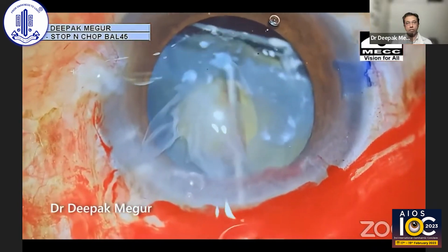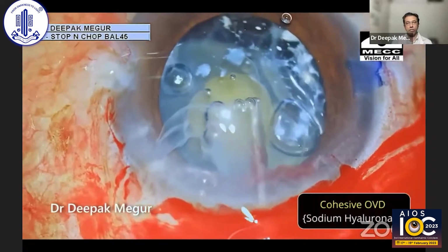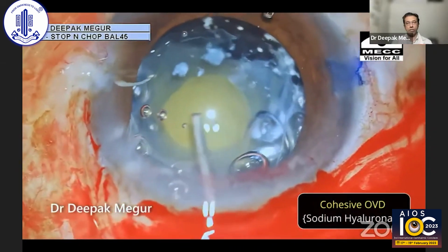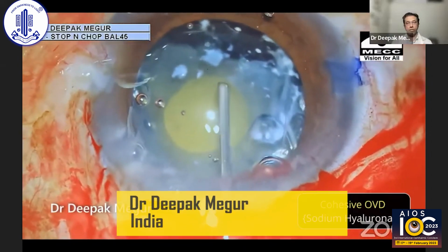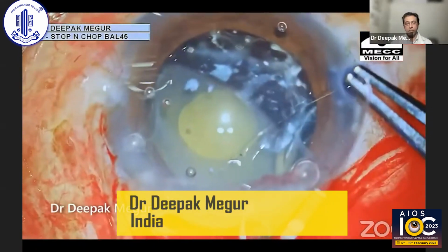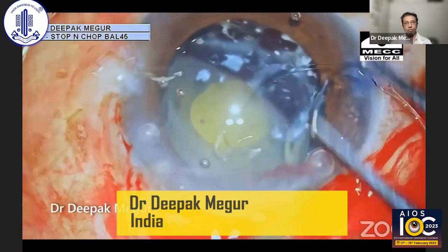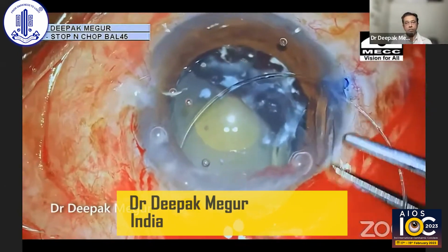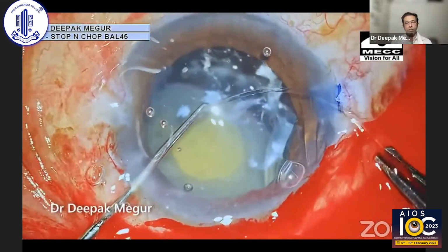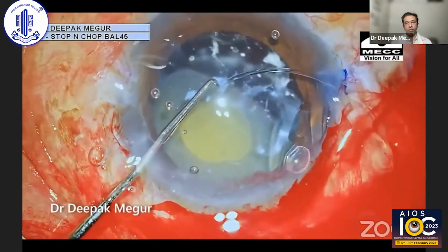Before I do that, again, I fill the bag and inflate it with the cohesive OVD. I'm using sodium hyaluronate that will create space within the bag and push it across. And when I'm trying to insert the ring, it will not cause any stress on the loose bag. So that's the idea of using that viscoelastic. So viscoelastic is holding the bag in place until the CTR is being threaded into it.